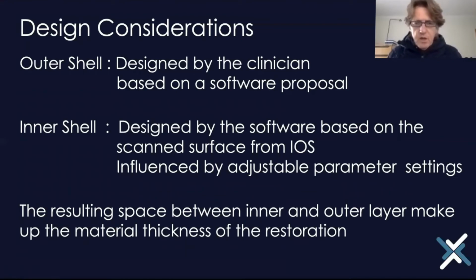The only changes that you can bring about are parameter settings, i.e., if you make a spacer, there are ideal parameters for spacers, there are ideal parameters for your margins, and so forth. So these things you can't really change. In most cases, there are factory settings from the companies, but you can adjust them in terms of value, but you cannot change the shape or form thereof.